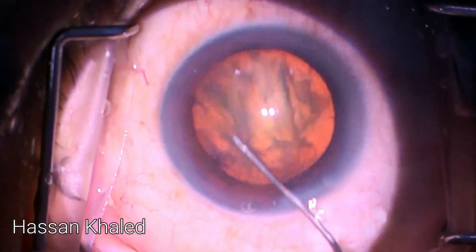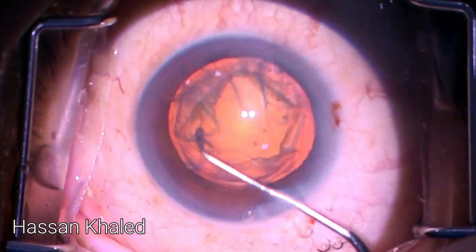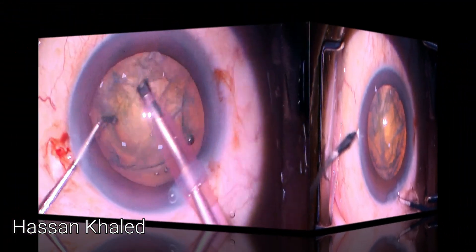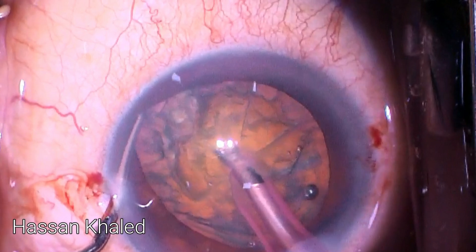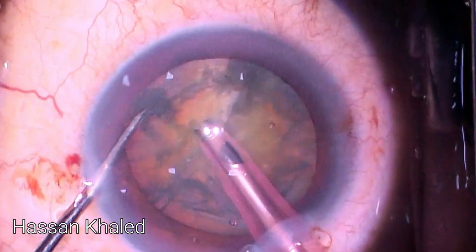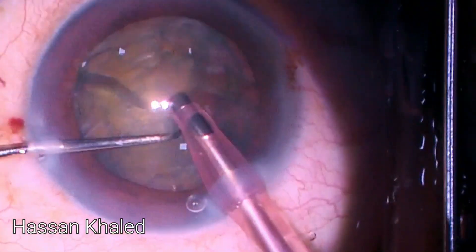The rhexis is centered and well-sized. Then I performed hydrodissection, two paracenteses, then rotated the nucleus — you can see complete rotation. Now it's time for chopping this dense nucleus; I'm applying a horizontal chop technique, chopping and splitting the nucleus into two halves, then each half into smaller pieces.